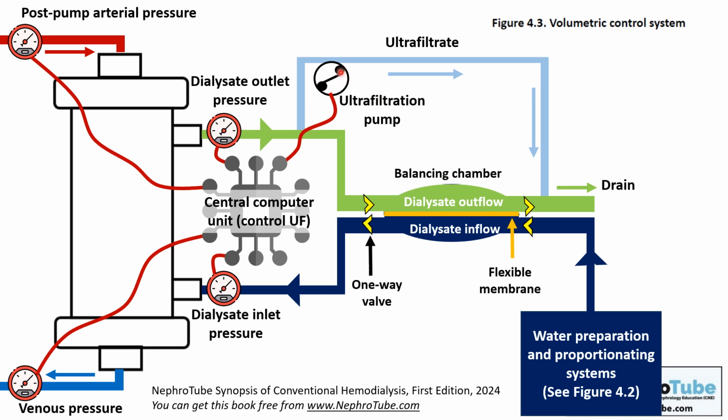Actually, there are multiple engineering methods for how the ultrafiltration pump works, and I may have mentioned one of them here, but I think as clinicians we don't need to know more than this. Just the main idea: the hemodialysis machine itself controls this ultrafiltration pump to ultrafiltrate the amount of water that was decided to be removed from the patient.